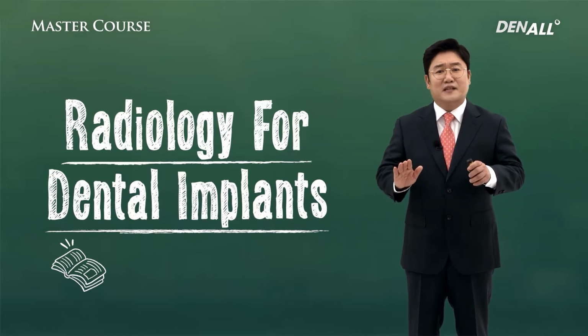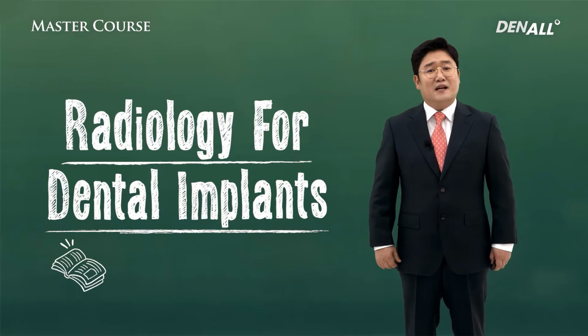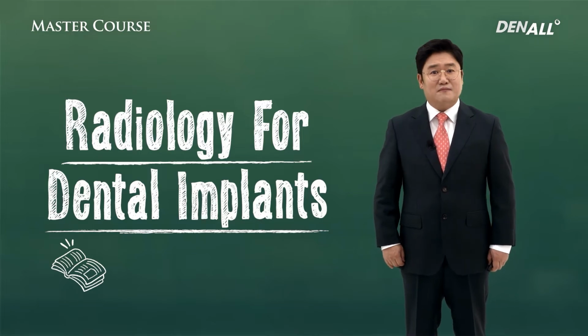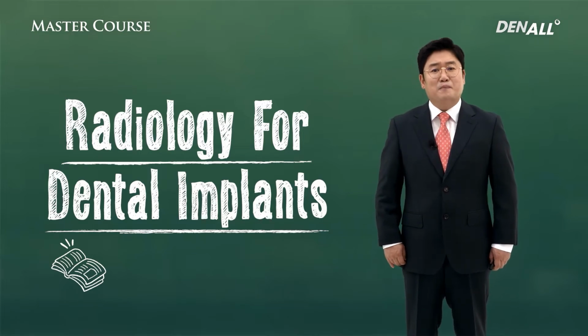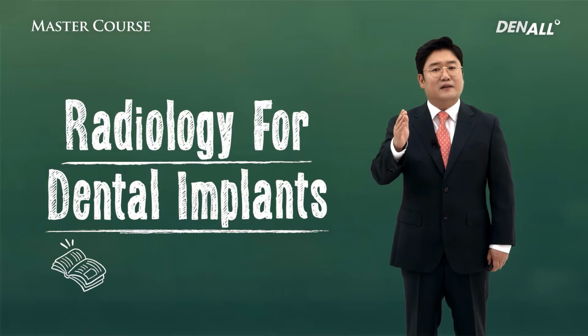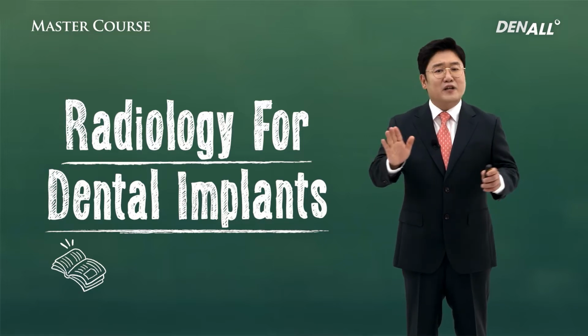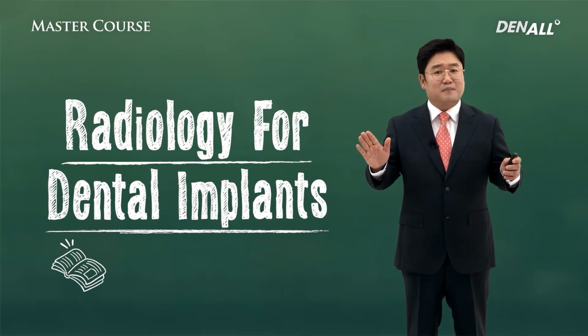It is performed as a daily routine, so relatively, it is considered as trivial, not very important. But when it comes to studying implantology, we need to record, diagnose, and interpret each and every individual patient's situation, so its importance cannot be overemphasized.